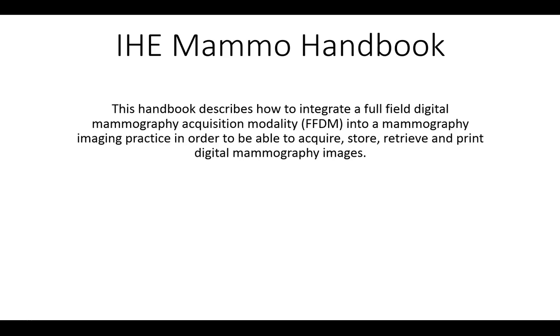Okay, let's talk about the IHE Mammo handbook. This handbook describes how to integrate a full-field digital mammography acquisition modality into a mammography imaging practice in order to be able to acquire, store, retrieve, and print digital mammo images.